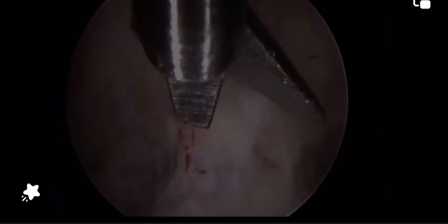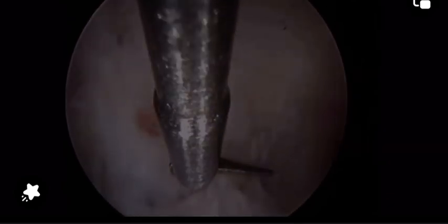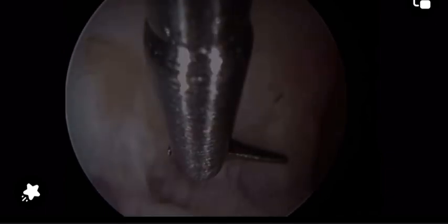So when you face some bleeding during cutting, this is because the intrauterine fluid pressure is not enough to tamponade the bleeder. And the presence of the scissor in the operative channel occupies the shaft of the sheath, which is also the same shaft for the fluid inflow.